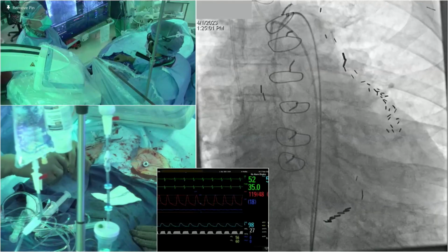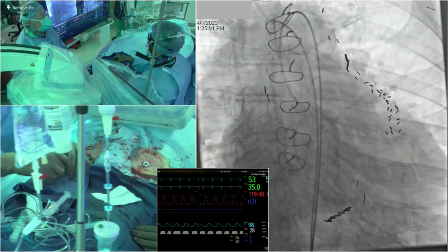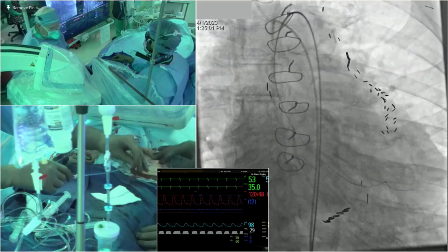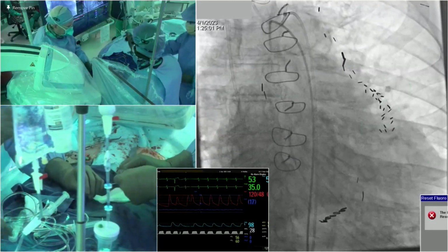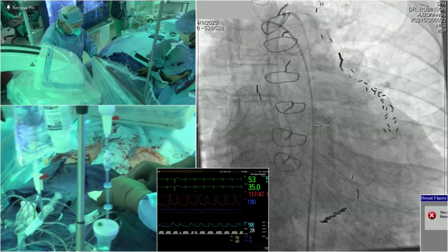One of the things that helps reduce stroke is minimal manipulation in the root. And what we found here is the jet, because you should see the wire flicking when you're in the jet, and then it's just a matter of timing. Just get it when the valve's open.